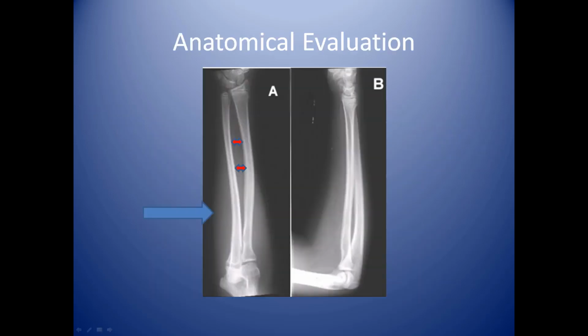Now, I've combined both images together, the AP with the lateral, to start off with, simply so that you'll understand they're very close to one another. If you're not used to looking at these x-rays, it can be confusing. So I just want to highlight some of the differences so that you can readily look at a film and tell.